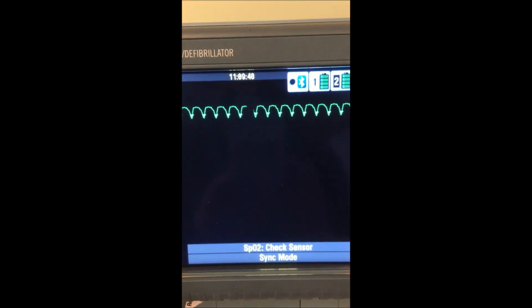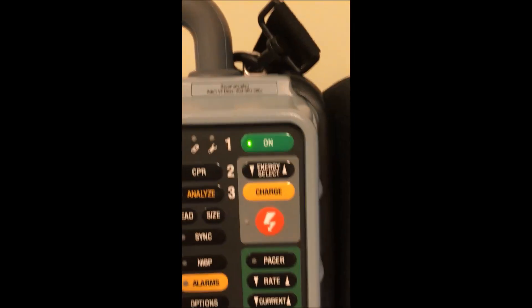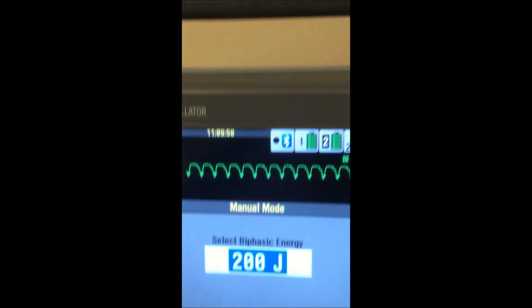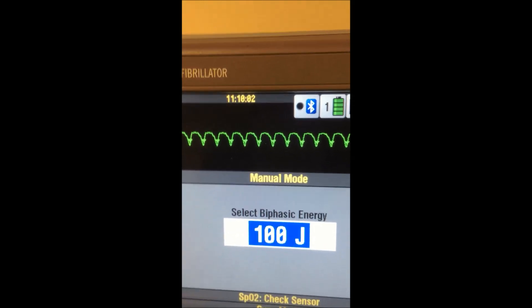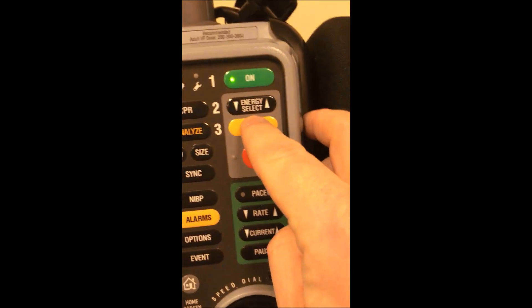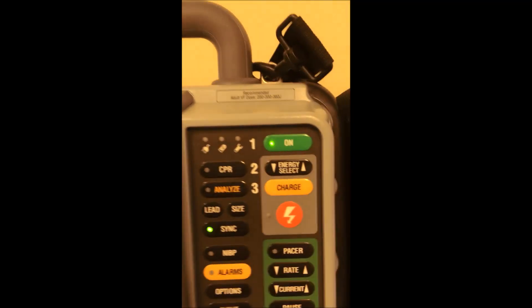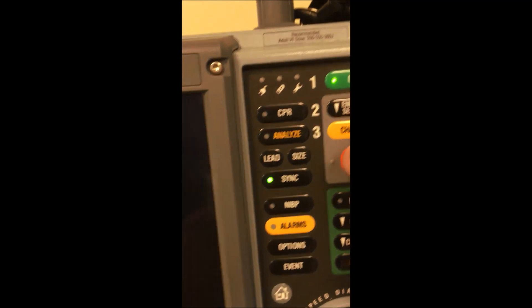Now we're ready to do a synchronized cardioversion. I'll press energy select. This machine defaults to 200 — we'd usually start a little lower than that — so I'm going to start at 100 joules. I'm going to press charge. At this point, you call clear, you're clear, everyone is clear, and shock.